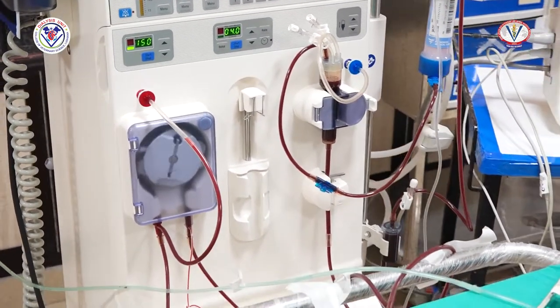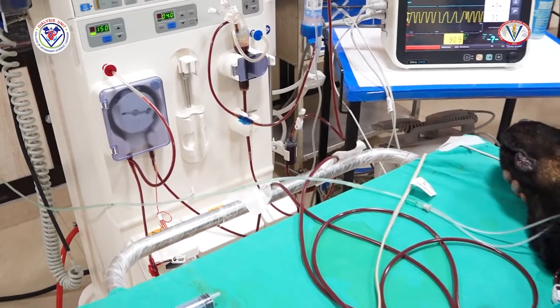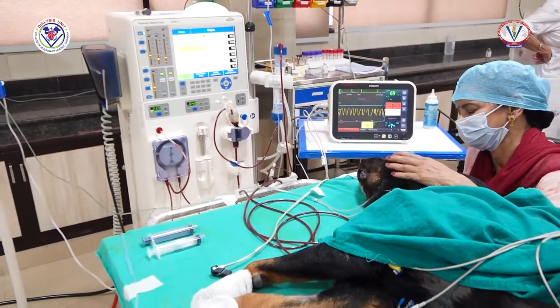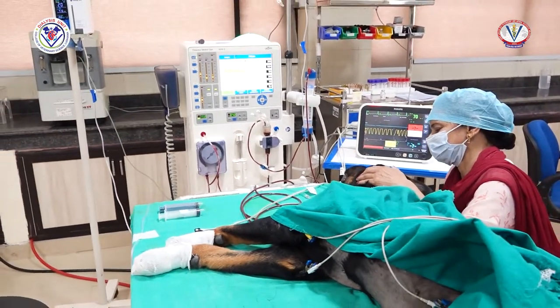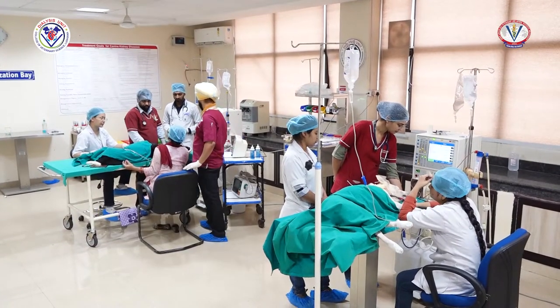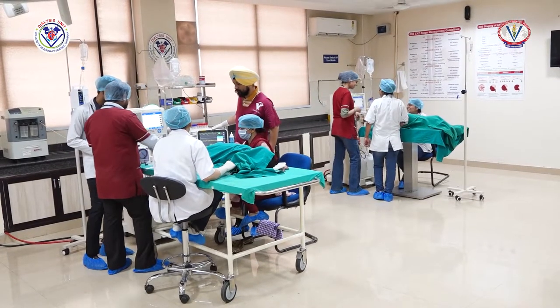Flushing of the blood tubing with normal saline solution or heparin is performed intermittently to reduce the risk of blood clotting in the extracorporeal circuit. Make sure not to infuse heparin in the last 1 hour of dialysis, as it may lead to increased bleeding risks if the catheter is intended to be removed.